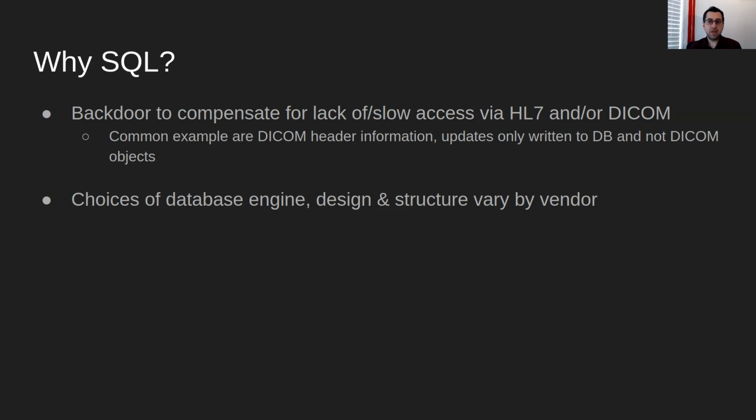Now, keep in mind, just because a database is an option doesn't necessarily mean it's the one to use every time, because there will be cases when you have information that's not stored in the database. Just as a random example, imagine if you're trying to retrieve some private DICOM attributes. These are very unlikely to be stored in the database.